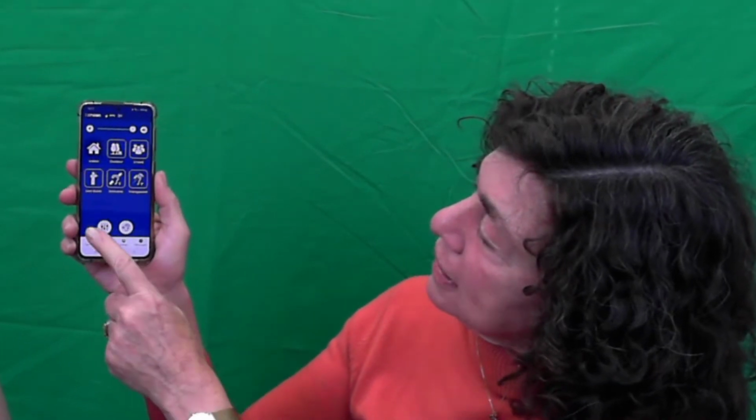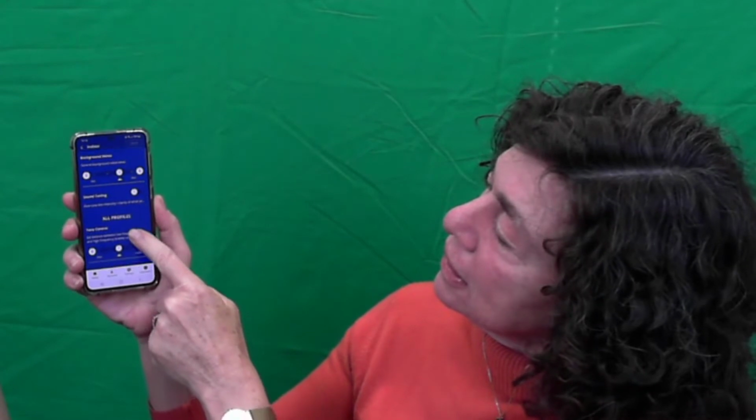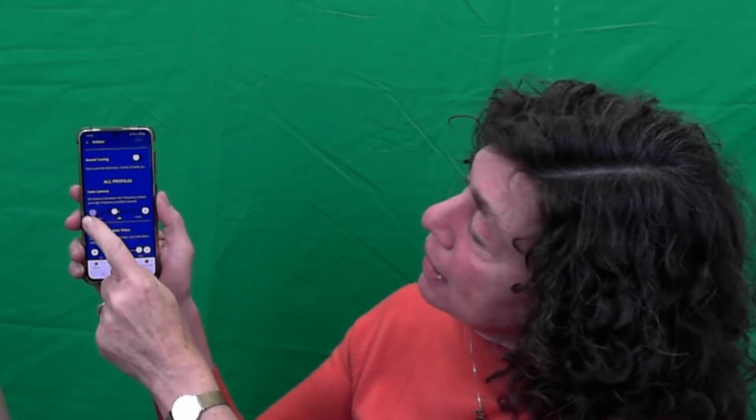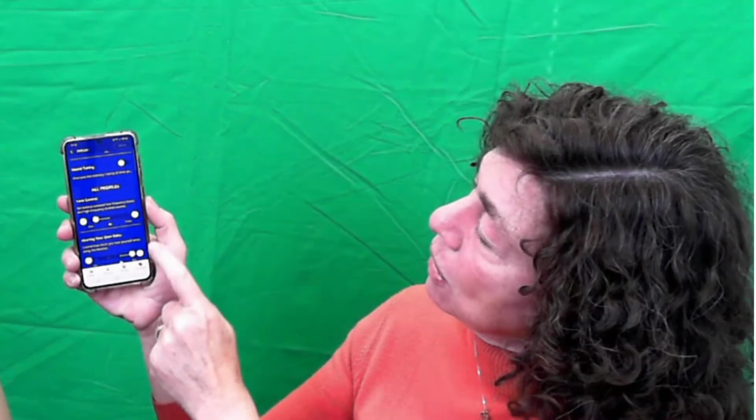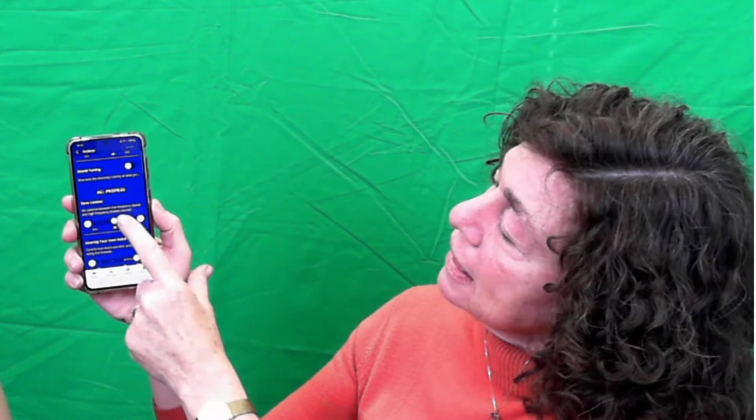Of course, you can also use the app to adjust the tone control. On the home screen, tapping the equalizer button and then scrolling down to the tone control area, you can tap on the left button to emphasize bass, or on the right button to emphasize treble or high frequencies. If you want to put it back in a balanced position, just slide that back to the middle. Did you hear the difference?